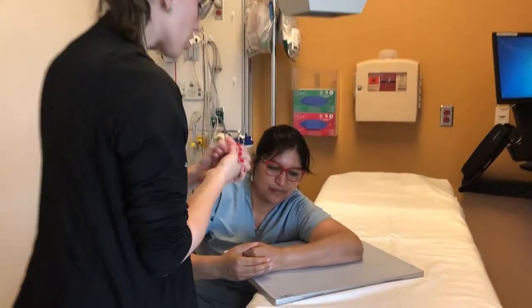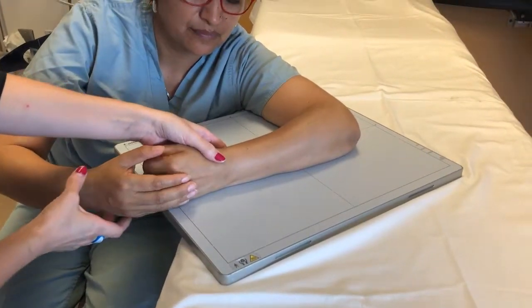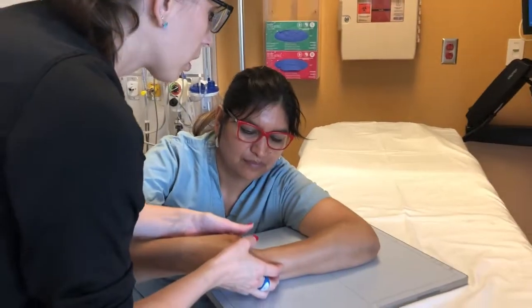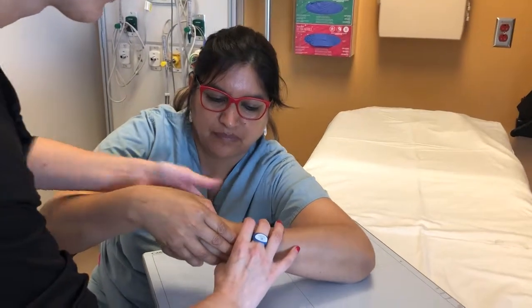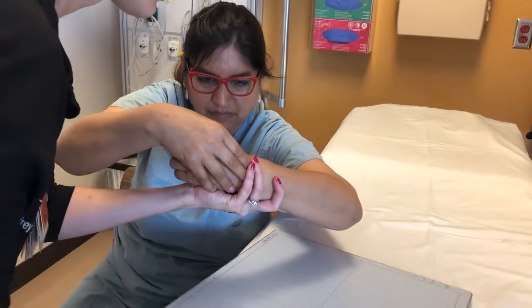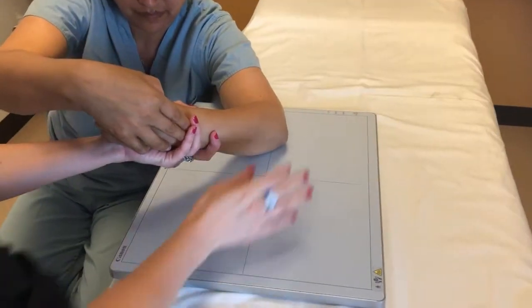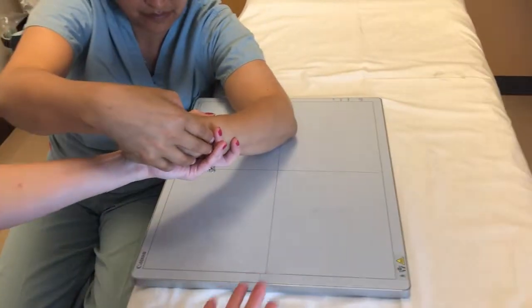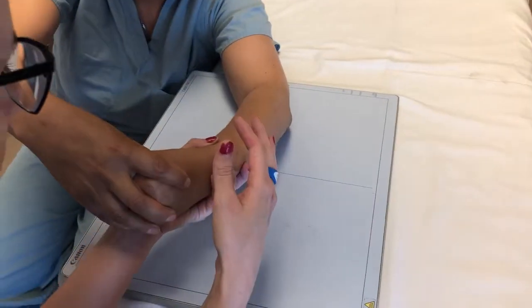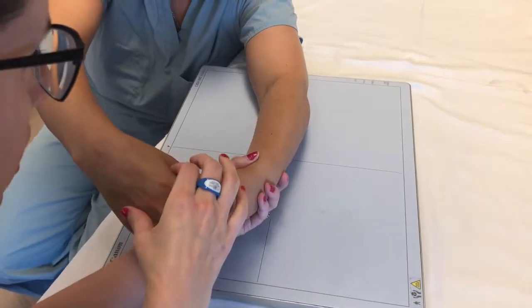So with your patient in this position, we go ahead and have them, because they feel generally more comfortable doing it themselves, we're going to roll your arm up. We're going to hold it up, up, up. There we go, very slowly, very slowly. And while she's doing that, she's concentrating on other things, and I'm going to adjust this so that we are in plane for her. Perfect. Rest that down, talk to them, just give them reassurance that they can do this, and have them relax their arm out a little bit more. Okay, go ahead and let go here.